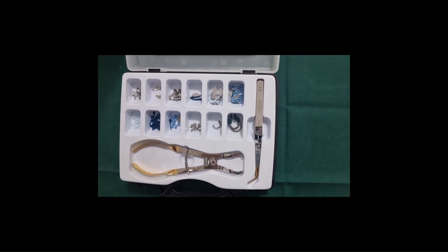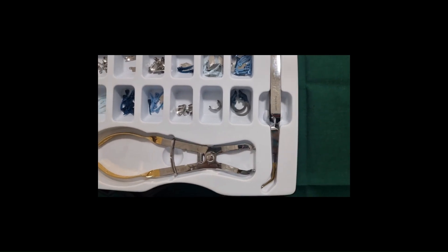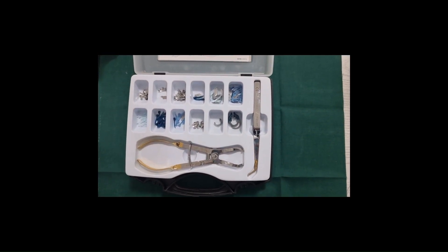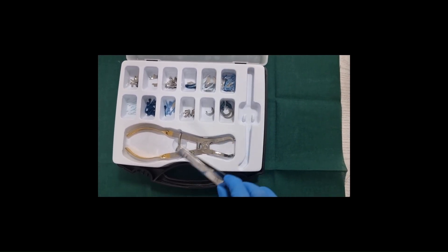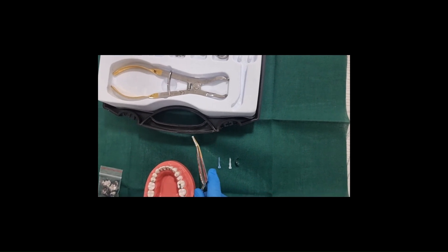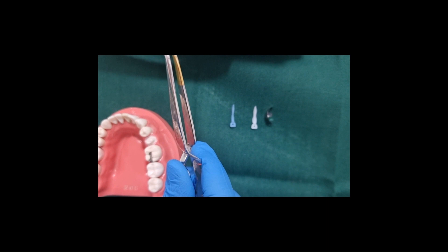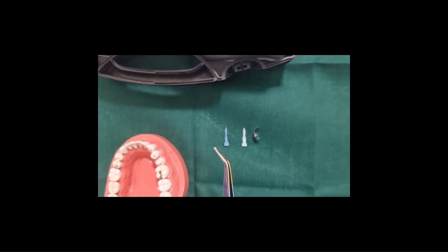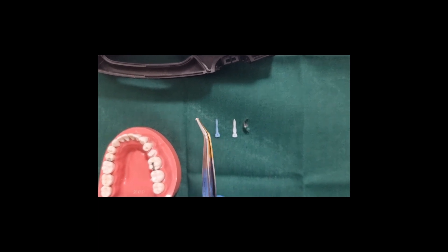This kit has various sizes of bands, wedges and wedge guards. The kit also has a pin tweezer for holding the wedges and matrix. The pin and tip of the tweezer grips the hole in the wedge and matrix for easier placement, reducing the chances of dropping them.